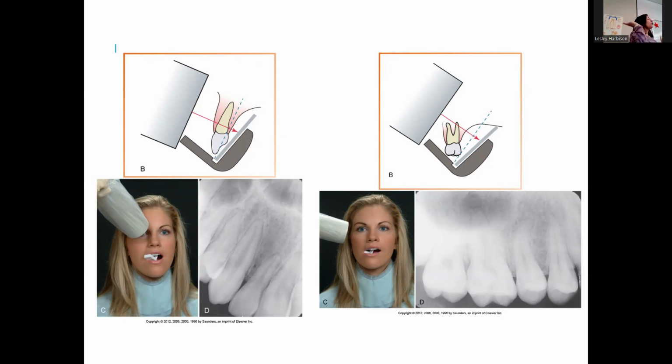And so it's farther away from the source of radiation. So that means that by the time the beam gets to that palatal root, it's more dispersed than when it captures the first 2 roots. So the palatal root always looks bigger, a little bigger and longer.